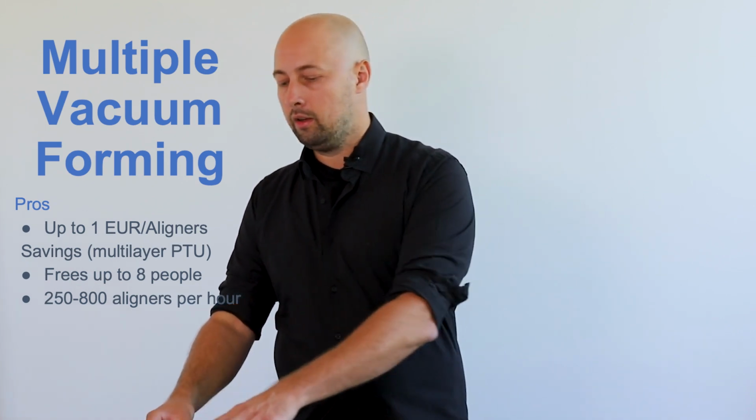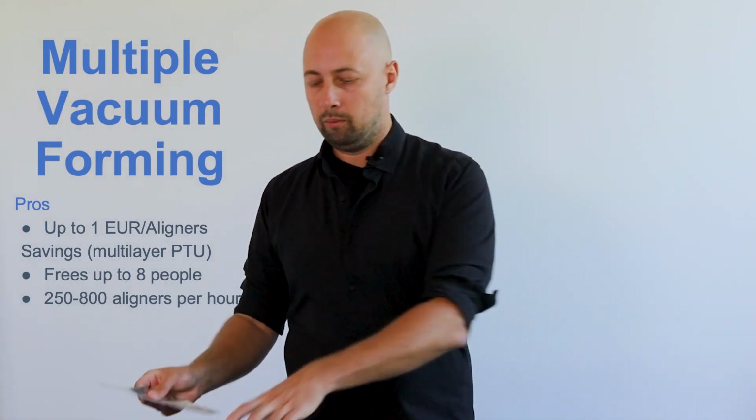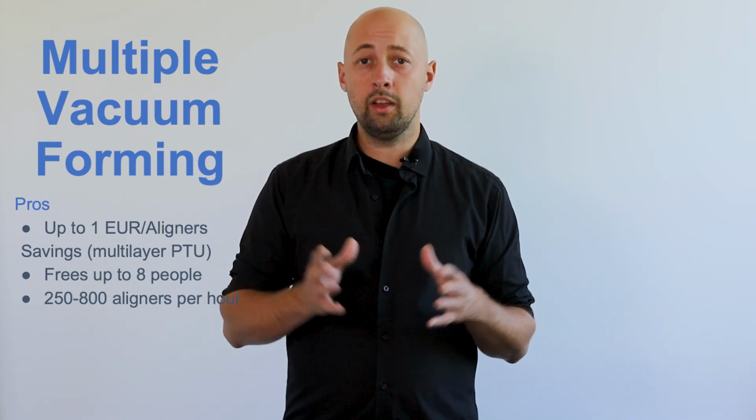But the pros of this module are the following. So you can save money on the aligner materials by purchasing not the retail aligner foils, but the big rolls of aligner materials. So when you do it this way, you save up to €1 per aligner when you use the multi-layer PTU materials. When you use the more affordable PETG single layer materials, the economy is not that significant, but still there is some.